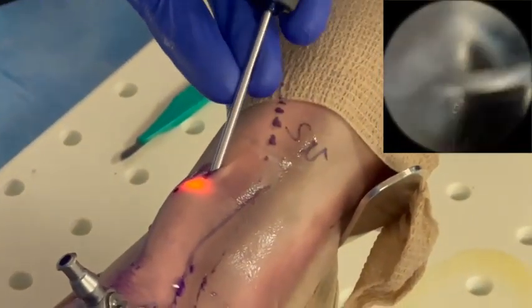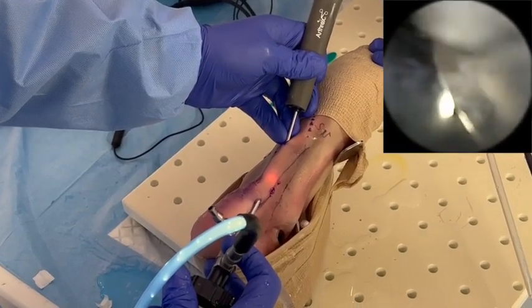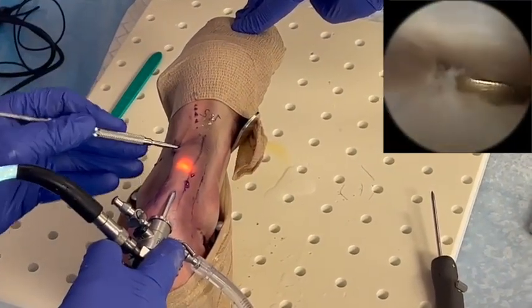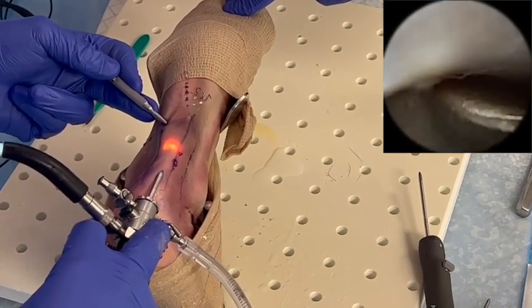A 2 mm shaver is inserted into the proximal medial portal to debride the impinging tissue between the paratenon and Achilles tendon. A freer elevator is used to circumferentially release any adhesions between the tendon and paratenon.